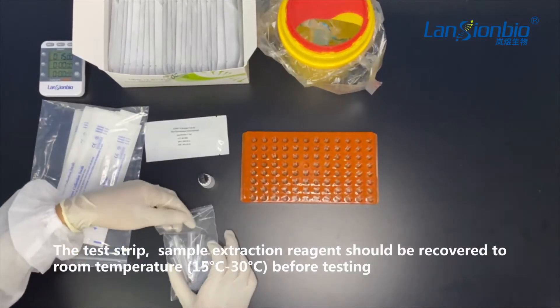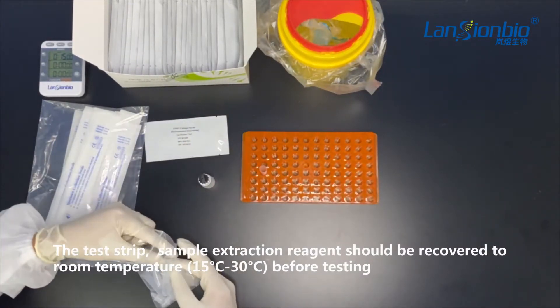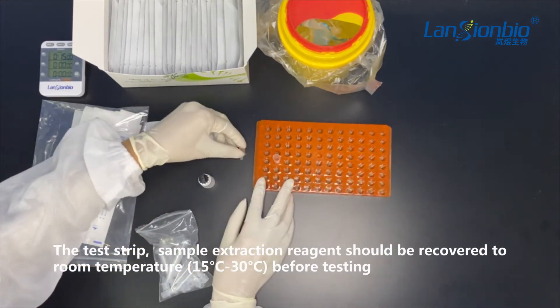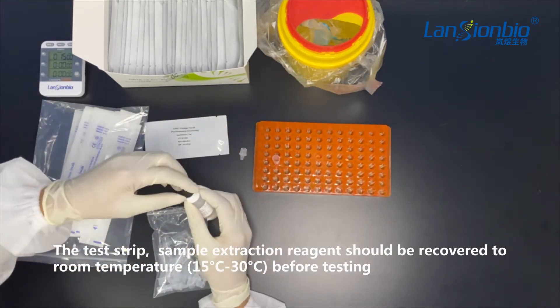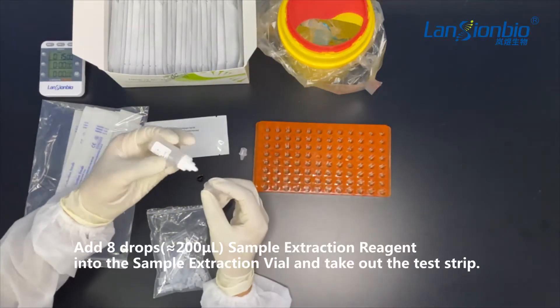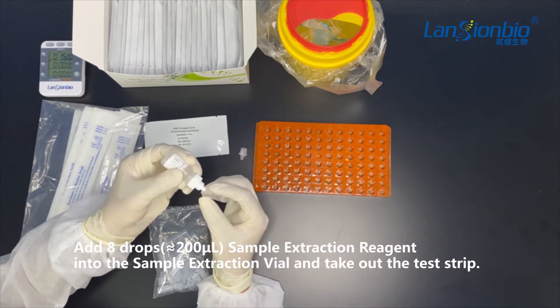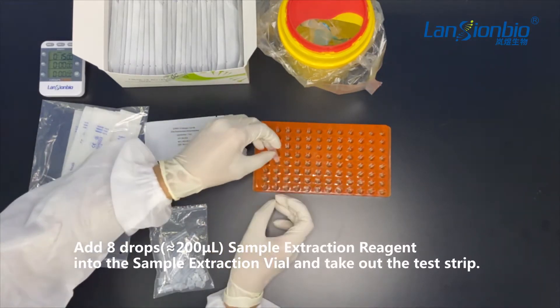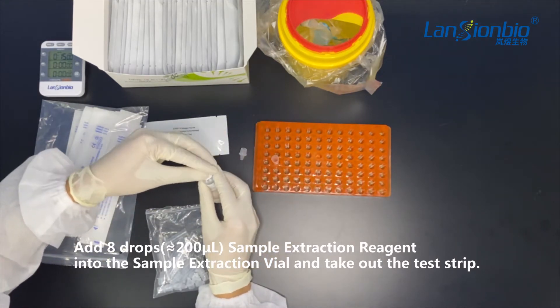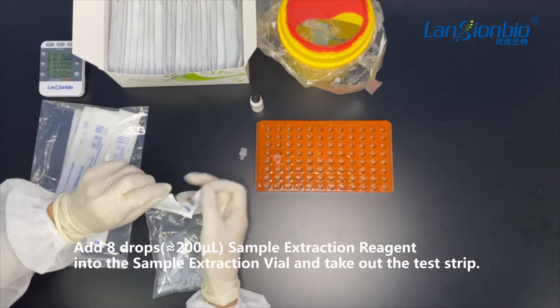The test strip, specimen, and the extraction reagent should be recovered to room temperature from 15 degrees to 30 degrees Celsius before testing. Take out the sample extraction reagent, add eight drops — about 200 microliters — into the sample extraction vial, and take out the test strip.